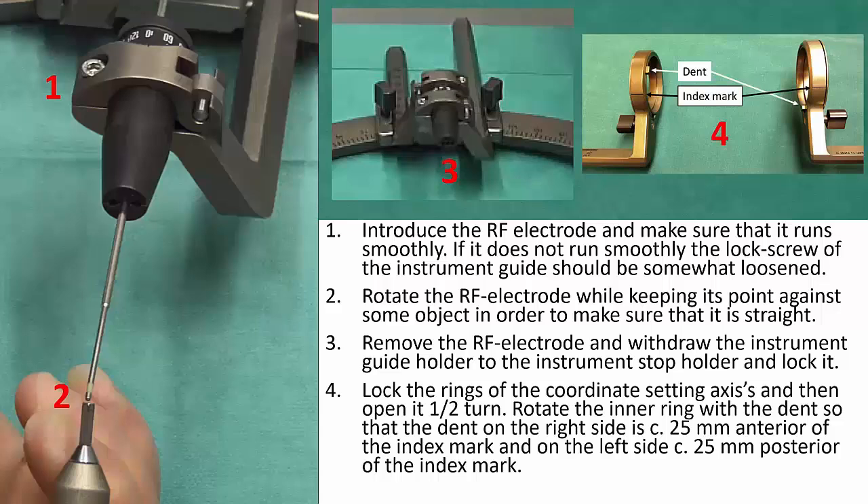Lock the rings of the coordinate setting axis and then open it half a turn. Rotate the inner ring with the dent so that the dent on the right side is about 25 mm anterior of the index mark and on the left side about 25 mm posterior of the index mark.